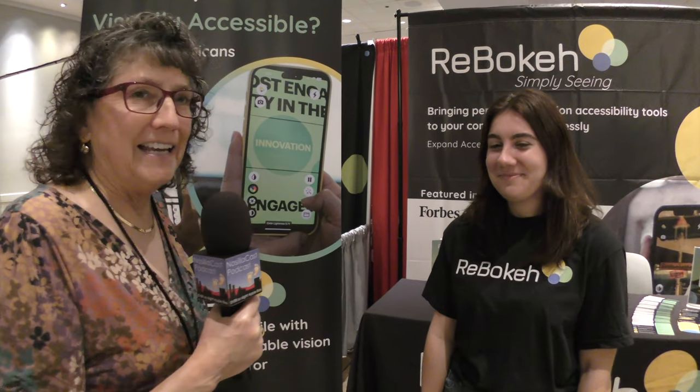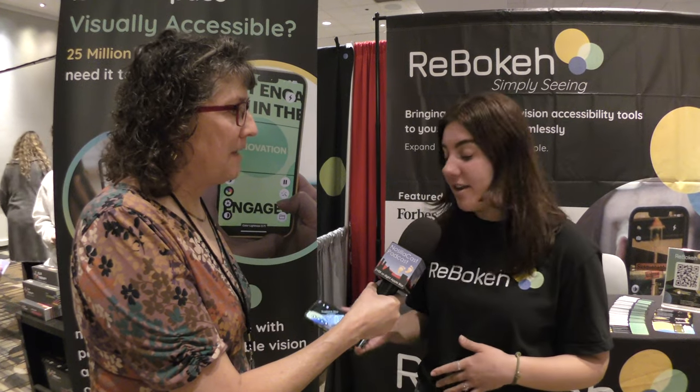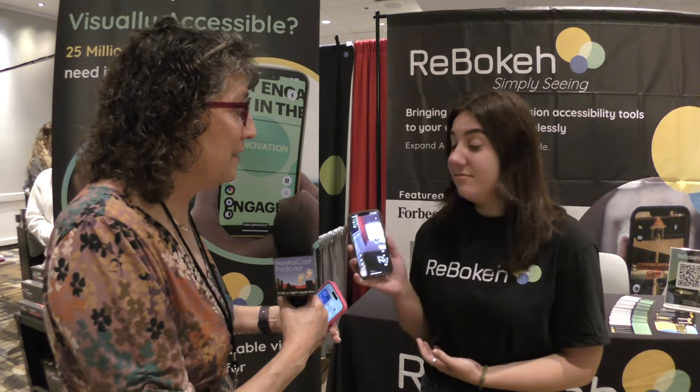I'm in the ReBokeh booth with Emerson Maggi and we're going to talk about an iOS app for people with low vision. ReBokeh was designed for low to moderate vision impairments — it's built on iOS, so every technology you need without a physical product you can get right on your iPhone in your pocket.